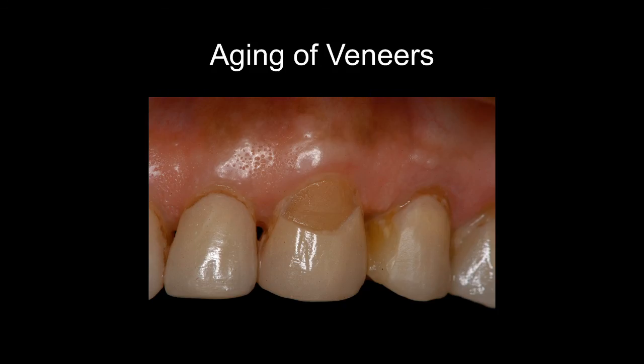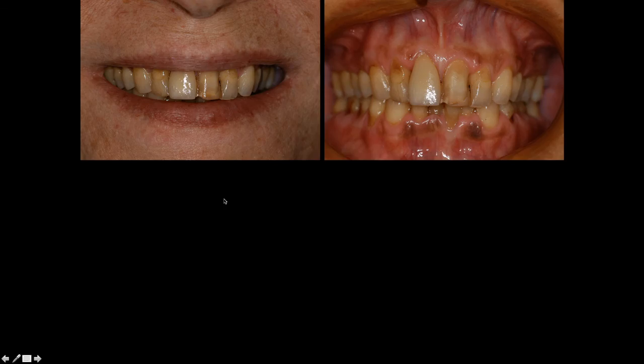You see the aging of the veneers. You can see here closely the fracture on the canine that was subjected to too much pressure on the cervical area, because we have less enamel on the cervical area, and this is the point where you have all the stress. And as you can see, the line of cement, the composite cement on the lateral incisor, debonding will happen. You cannot rely on dentine as in this situation. Dentine is not a reliable bond for veneers.